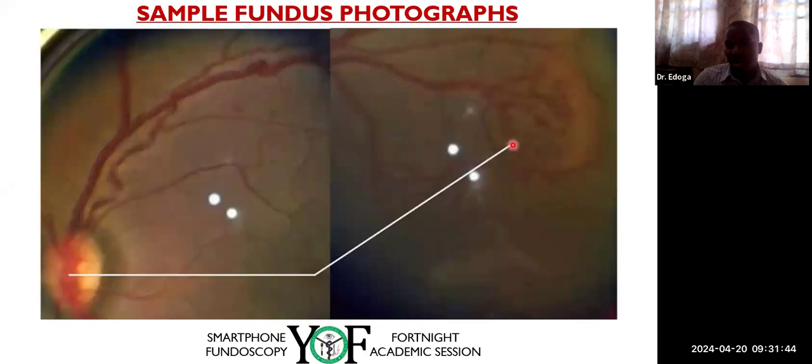Sorry, this is zone 1. This is twice the diameter. So this is zone 1. So from here, this is the radius, this is the diameter of zone 1. So anything outside this is zone 2. So you can see the ridge. And if you look well, you can see that it's raised, telling you that it has already reached stage 3.